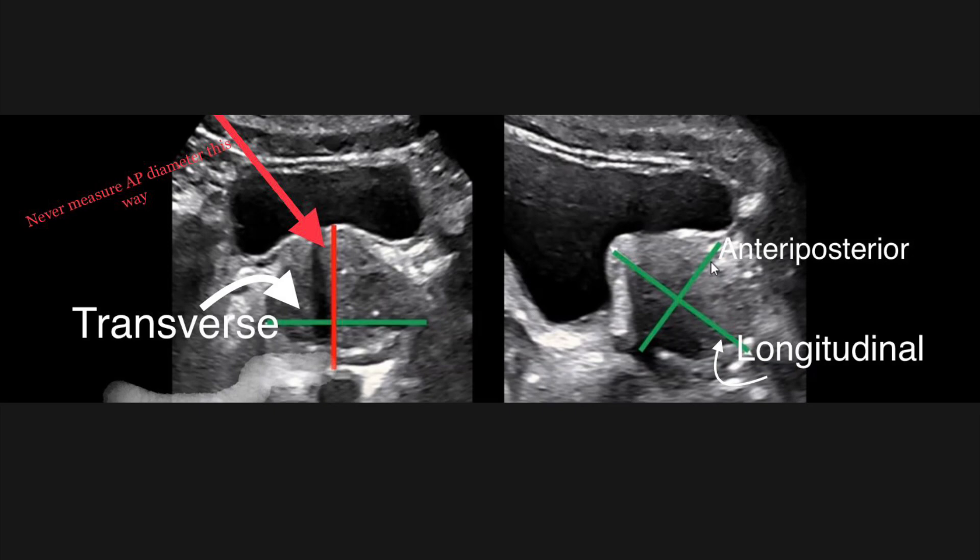Now measure the transverse diameter — that is the width of the prostate — on the axial image. Then on the longitudinal image, measure the remaining diameters: the anteroposterior diameter and the longitudinal diameter, that is the height and length of the prostate.